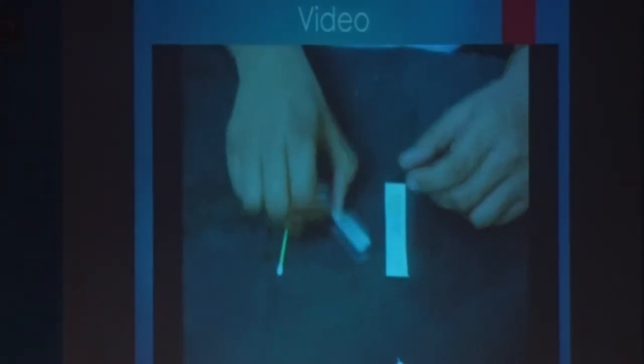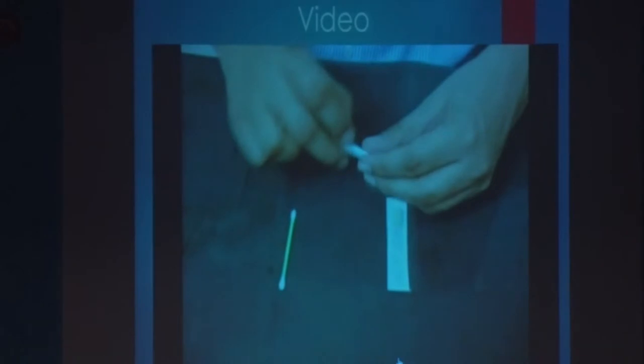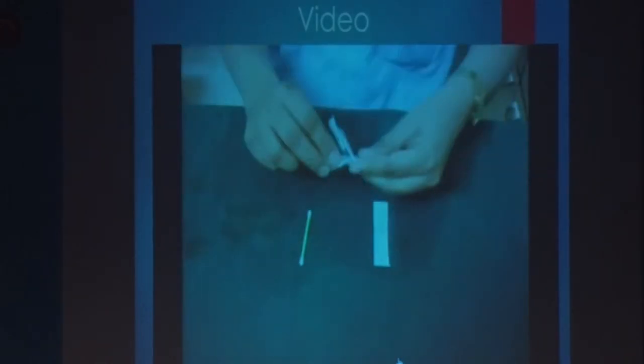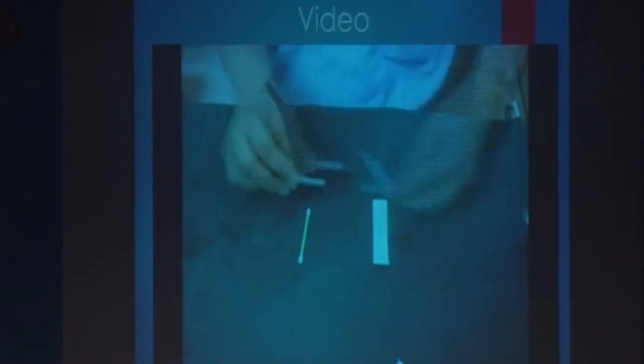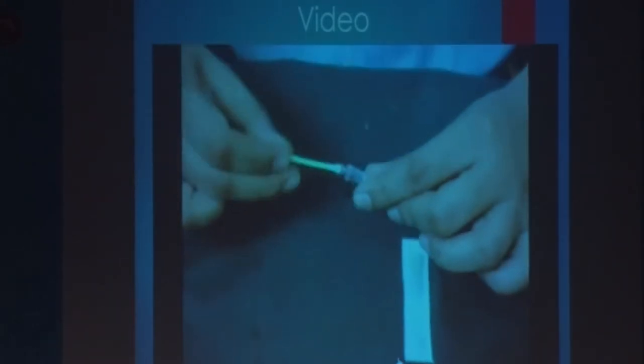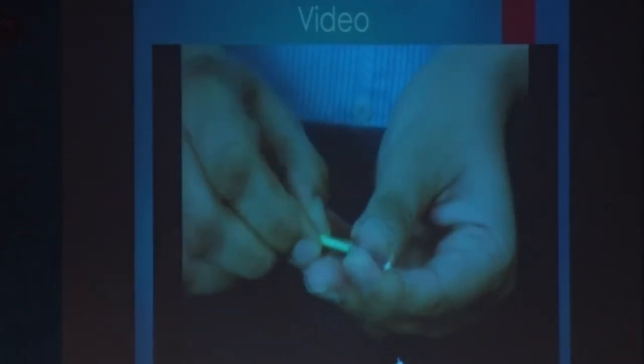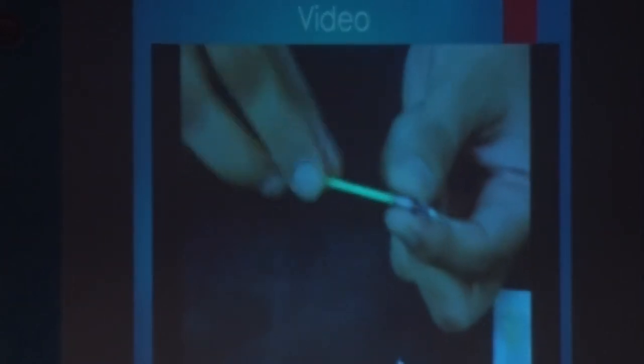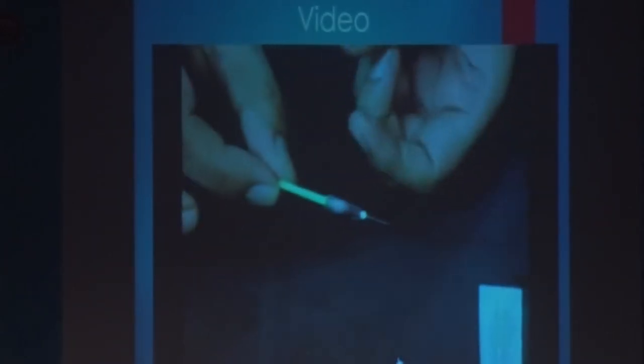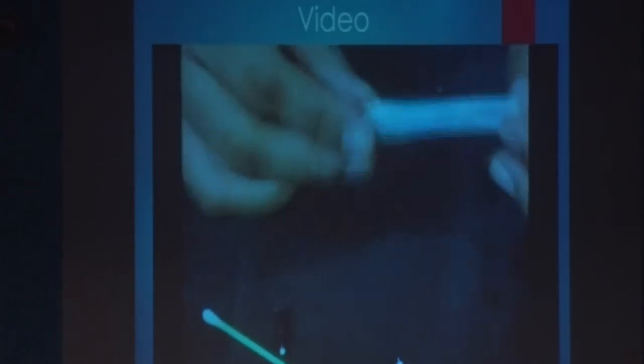I will show you the video. In this new technique, a 26 or 30 gauge needle is used, mounted on a sterile Johnson Bud. Just for demonstration, I am using an unsterile technique, but it is mounted on the Johnson Bud, and this is used as a pre-injection paracentesis before giving intravitreal injection.